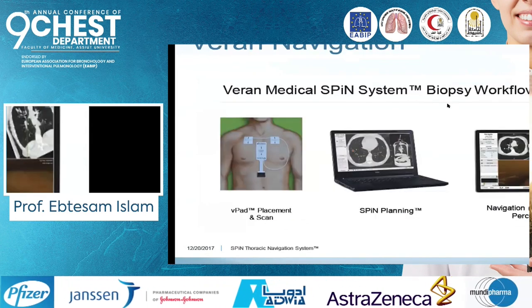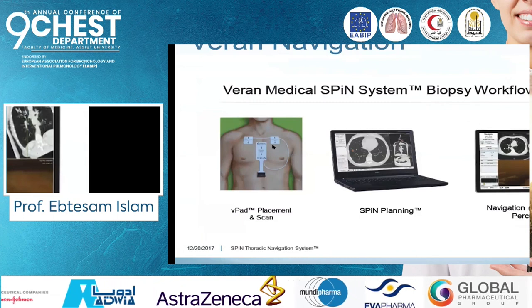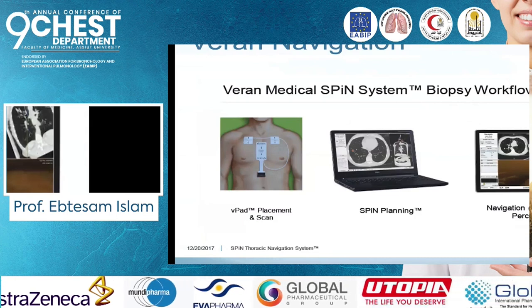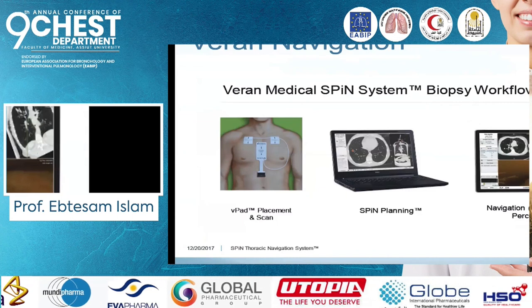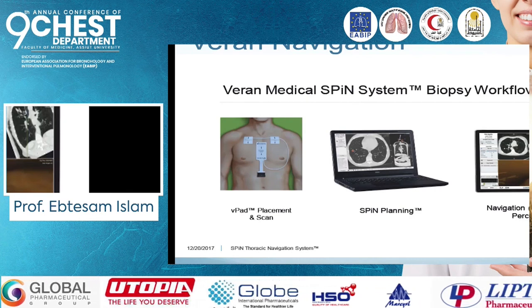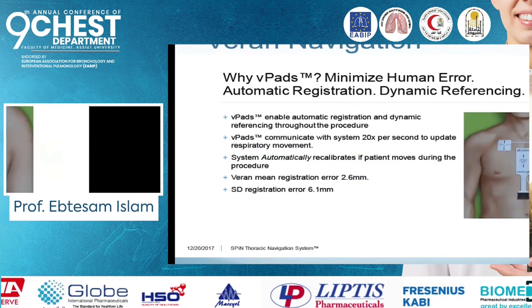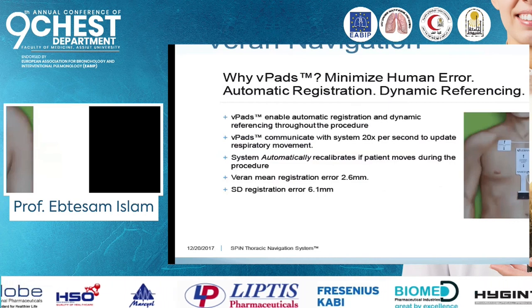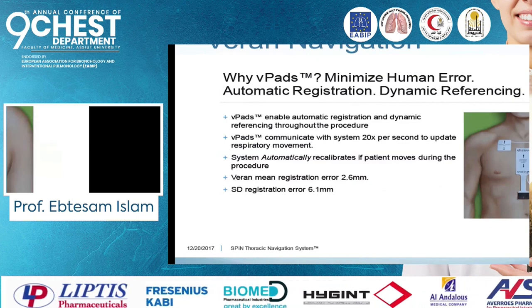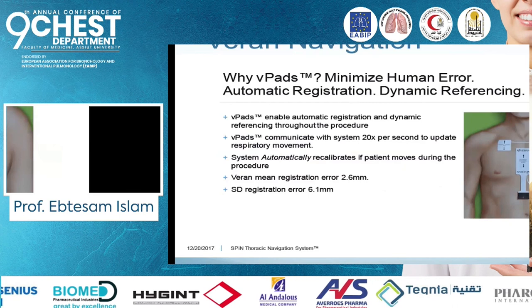So the biopsy workflow is that you have these VPAD placements and the patient is sent to a CT scan. The CT scan is then on the computer and we go through the images, picking a nodule or the target that we're interested in, or multiple targets actually. Then using that system and what we've targeted, we use endobronchial or percutaneous approaches if we need to biopsy the lesion of interest. So why the VPADs? How are these relevant? They provide automatic registration and dynamic referencing throughout the procedure. They communicate with the system 20 times per second to update respiratory movement, and it automatically recalibrates if the patient moves during the procedure. And the Veran mean registration error is 2.6 millimeters.